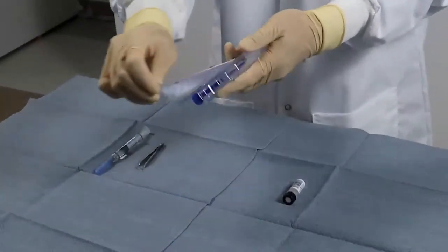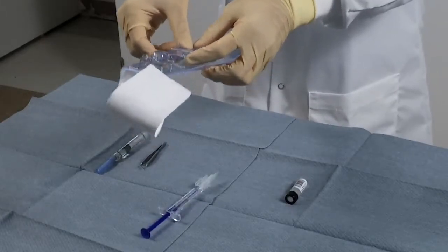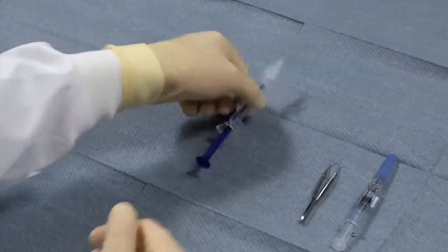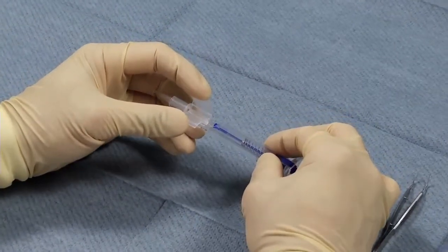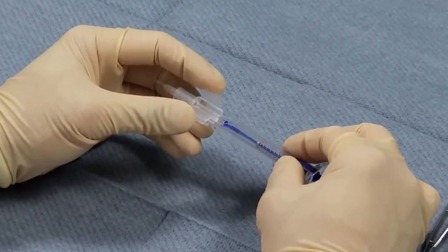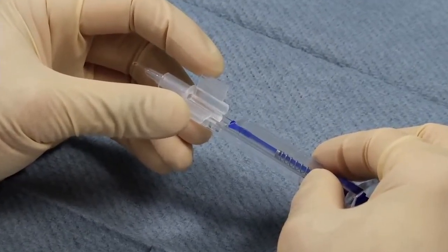First, open the injector blister tray and transfer the sterile injector onto the sterile field. Hold the injector in such a manner that the movable and fixed cartridge wings of the loading chamber can be guided with the index finger and thumb. Then open the loading chamber.